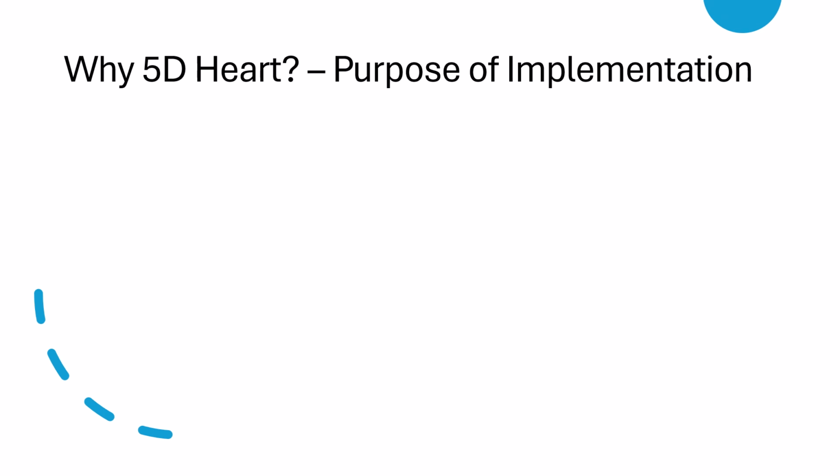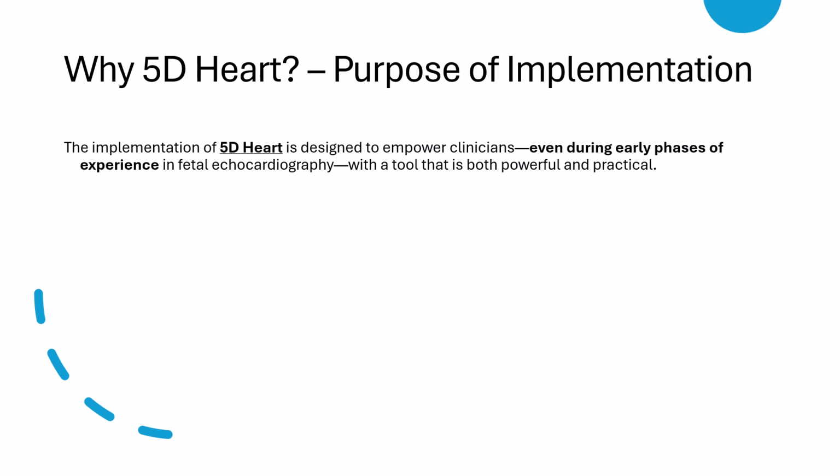Now let's answer a critical question. Why 5D Heart? What makes this technology more than just a new gadget in our imaging arsenal?